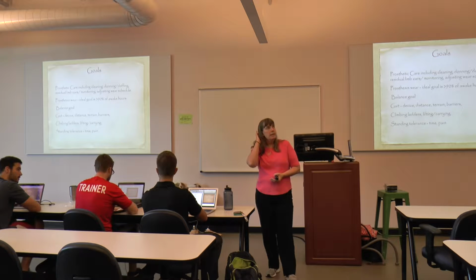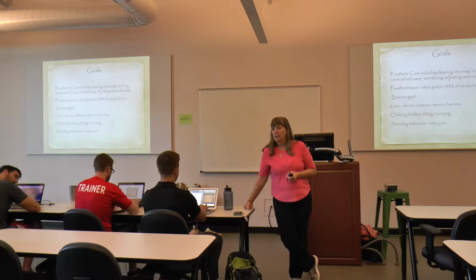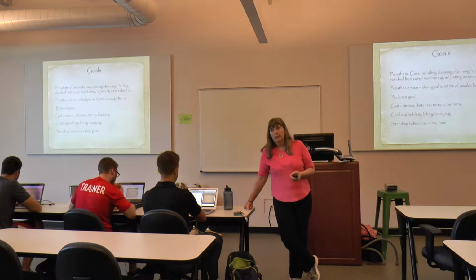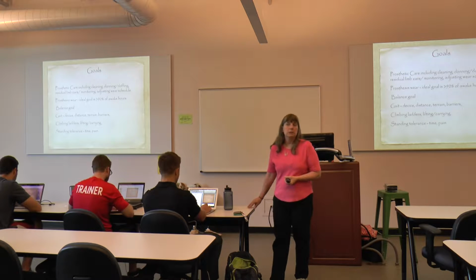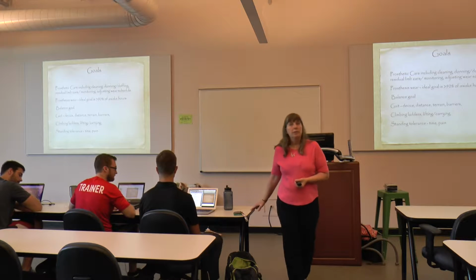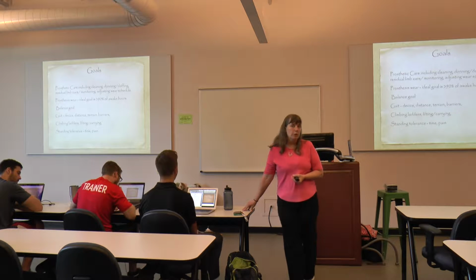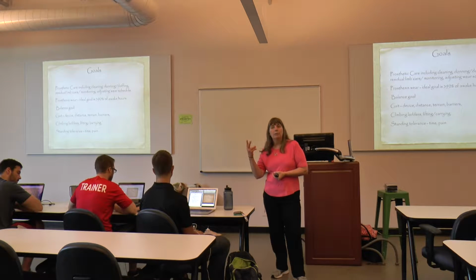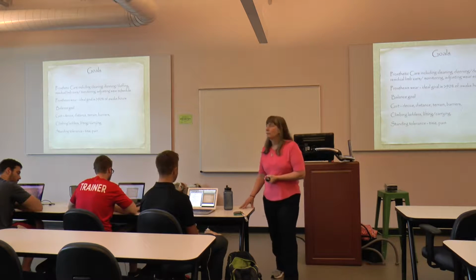And I stop saying my long-term goal at 12 hours or 14 hours because the awake hours differ for different people, okay? So if I do a percentage of their awake hours, then I'm getting where I want. Do I vary it off 90 depending on the patient? There are some patients, transfemoral, K1, K2, that I might go back to 80%, because I know typically they're ones that are going to take it off a little earlier before bedtime. Ideally, what I'm looking for is that they wear the prosthesis when they're not in the bed or the bathtub. If they're not in one of those two places, they have to be wearing it. That's ideally what I'm looking for.